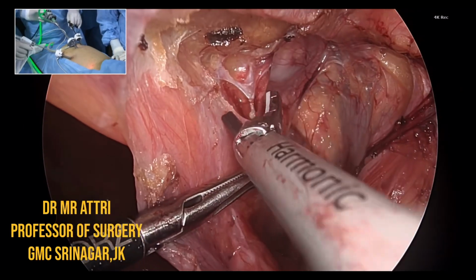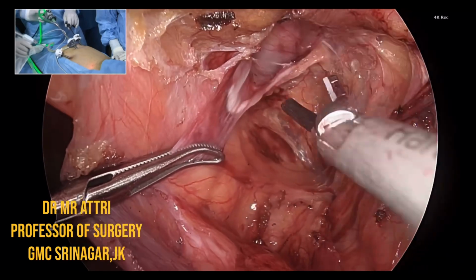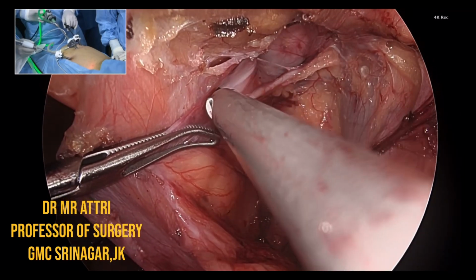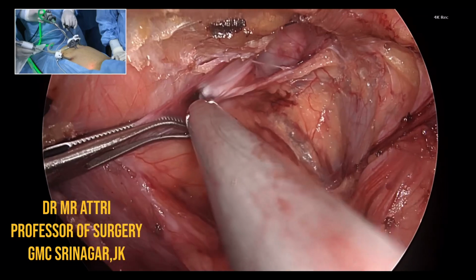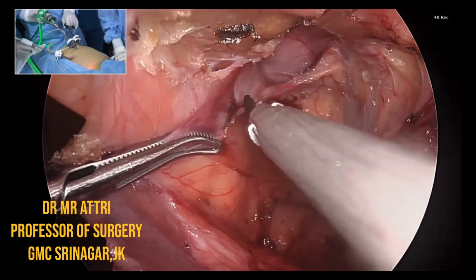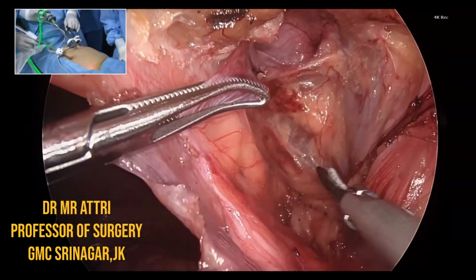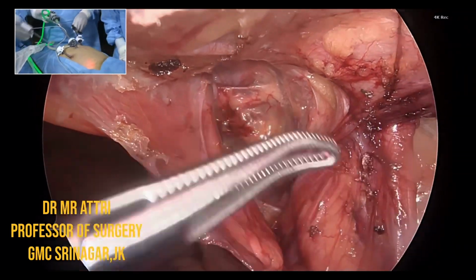Audiovisual number one, you can see the image from inside. It looks a very nice hernia. Number two, can we shift to Professor Atri because he's at a crucial phase. Then we'll just listen to Professor Safraz answering the question.